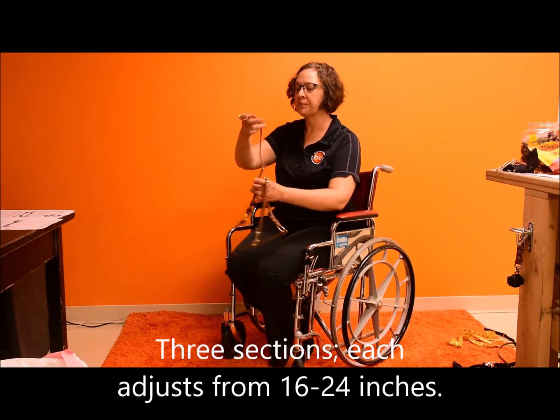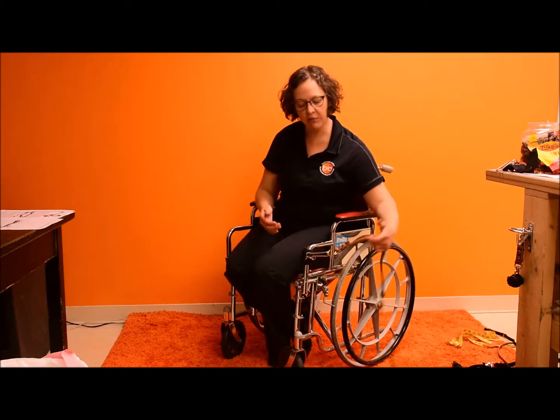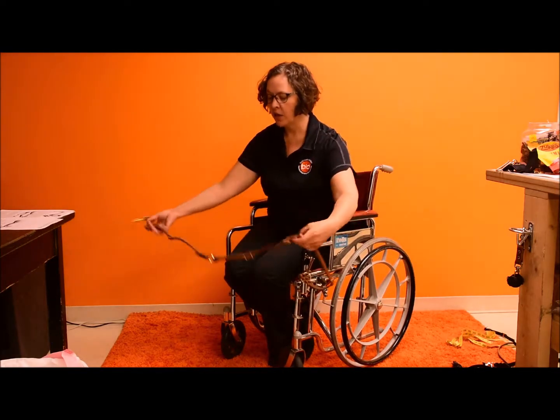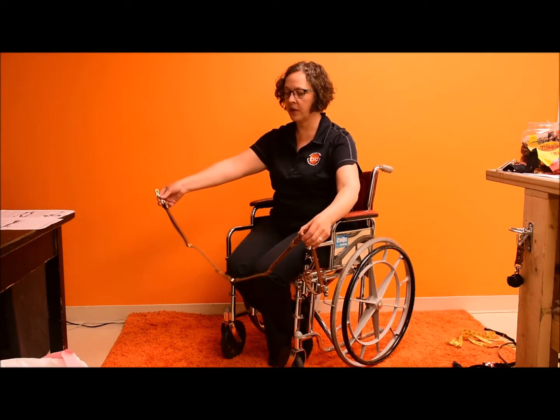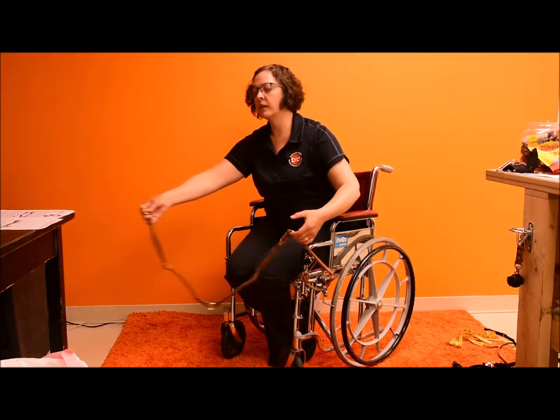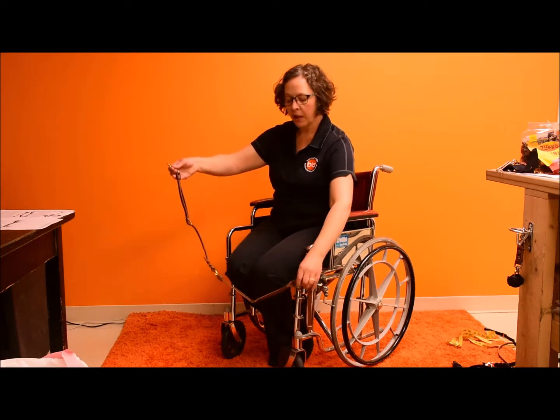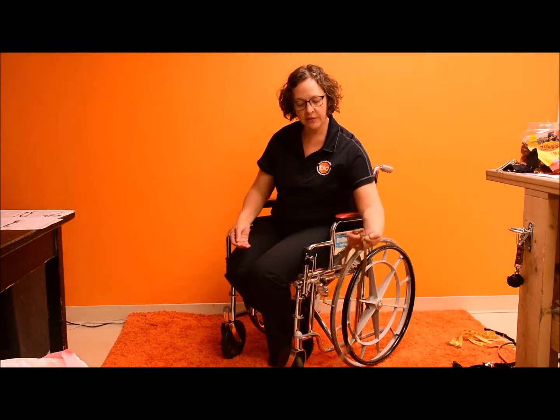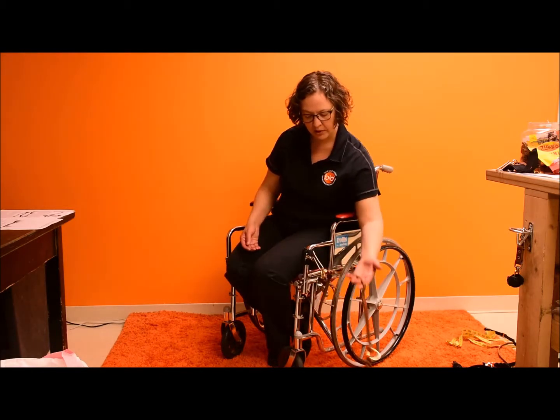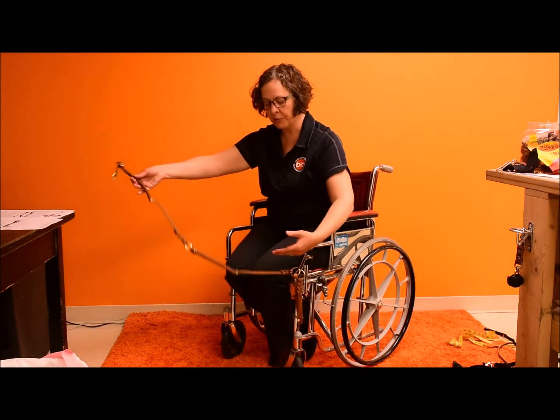So with the longer leash, you simply drop the 1 ring onto the hook, and then you have the nice long leash, which gives plenty of room for the dog to retrieve an object, get a little bit further away from the chair to do a task, or even relieving. Then when you need a medium length, you simply drop the 2nd ring onto the hook, and this gives you the medium length.